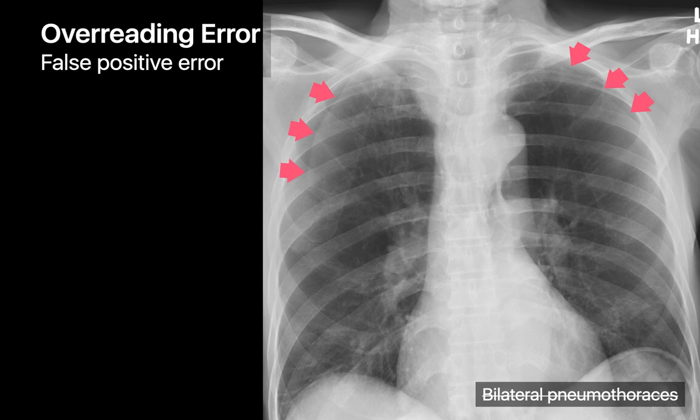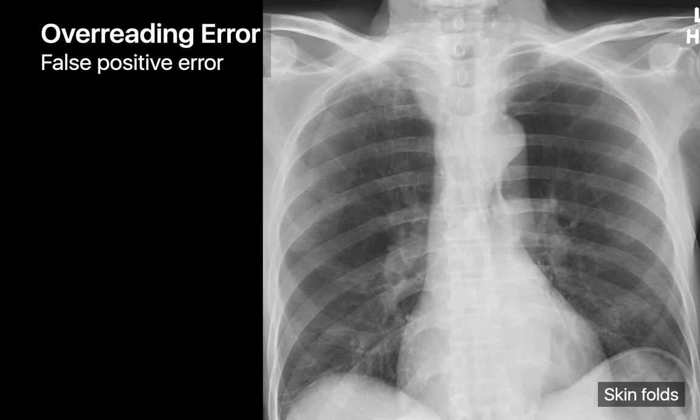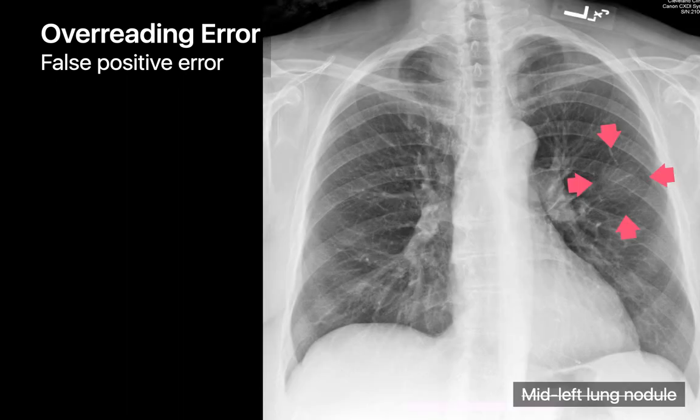Over-reading errors are false positive errors where a normal finding is interpreted as abnormal. Like this case that was thought to represent bilateral pneumothoraces but was just overlapping skin folds, or this case of an apparent lung nodule that was actually a non-metallic chest port in the patient's left chest wall.